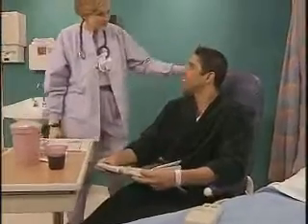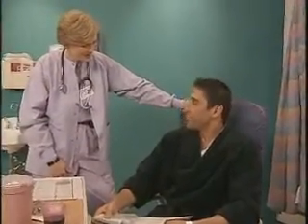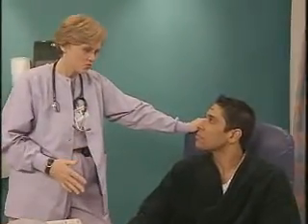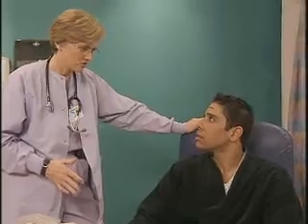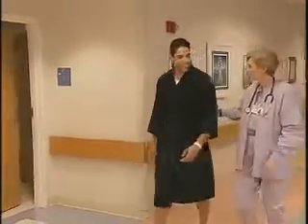As you've just seen, your role in caring for patients with chest tubes is a challenging one that requires expert clinical skills. But you can rise to that challenge every time when you know what to do before, during, and after chest tube insertion.